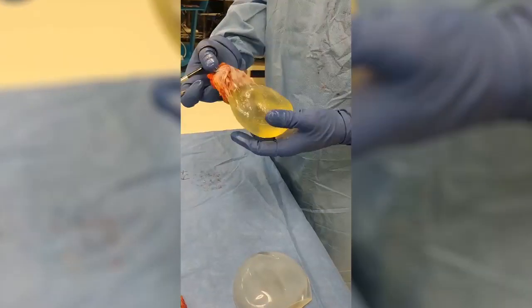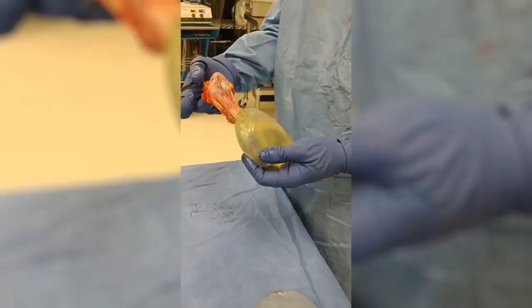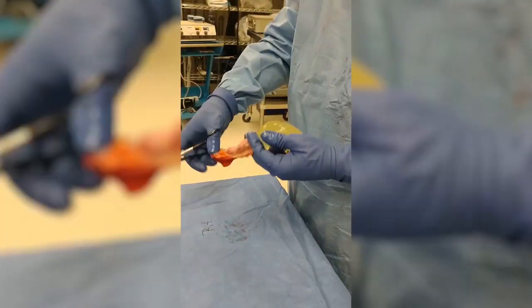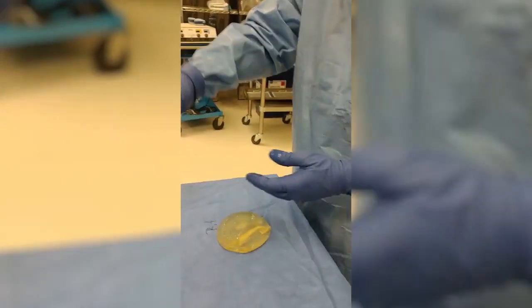And that's what we see with a rupture. This is why an en-bloc capsulectomy is so important — because we don't want all of this free silicone in the patient's body. So that's a ruptured implant.